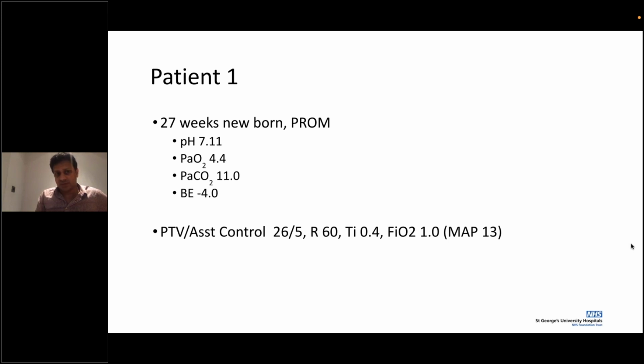So this is a baby where clearly the ventilation strategy is not working. You've decided to change to high frequency. What is the MAP that you're going to set? 15. So we're going to do 15, because we've got an earlier MAP, and that will be a good starting point. What is the frequency you're going to set? 10. That's a good start point. And what is the amplitude that you're going to set? Okay, we've got 45.